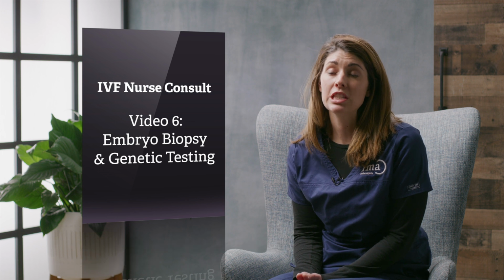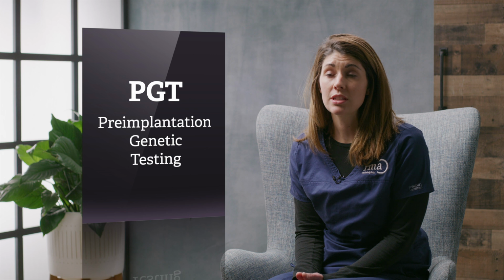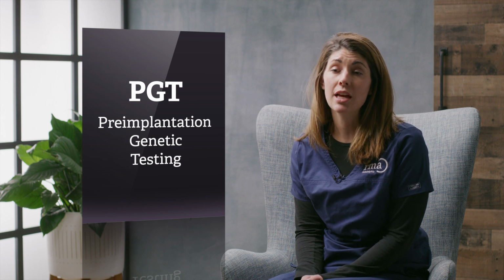Hi, now we're going to talk about embryo biopsy and genetic testing. Genetic testing is called PGT, or pre-implantation genetic testing, which is an optional test you can elect to have on your embryos, and it'll determine if your embryo has the usual number of chromosomes or not. Now, before I get too into PGT, I have Kate here, and she's going to tell us about why she chose to do PGT.